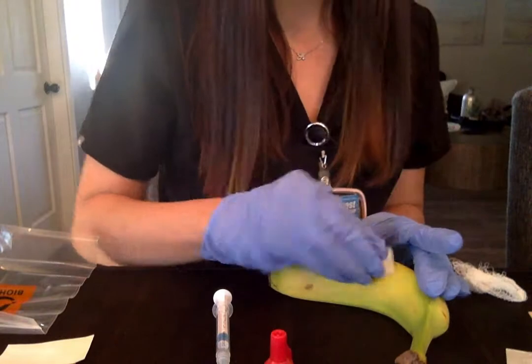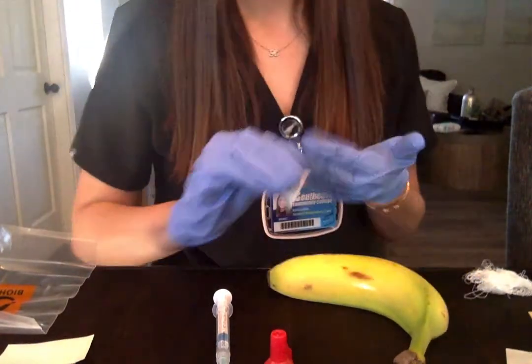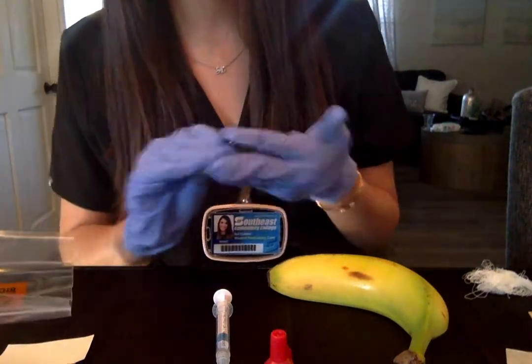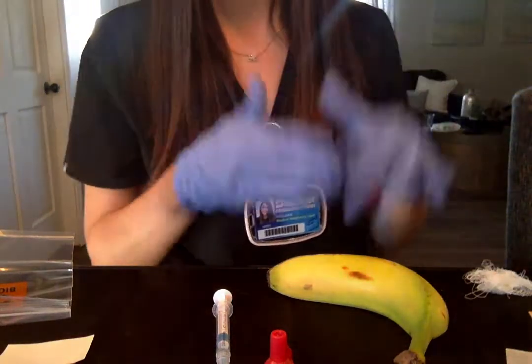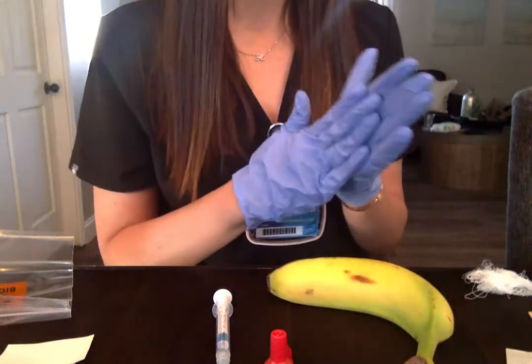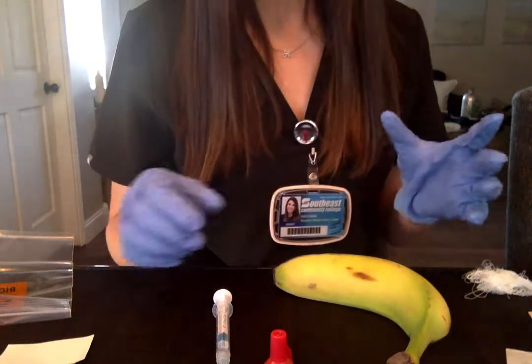I'm gonna grab my alcohol wipe and clean off the area I'll be puncturing, and clean off my fingertips. I've explained to this patient why we are drawing from an artery instead of a vein, and also to expect a poke and then some pressure. So I've cleaned the area.